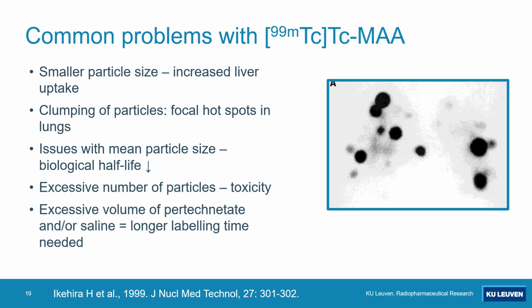Also, if you have too large a volume of your pertechnetate, even though you will only use a little bit of this for your patient, and it's all really safe, it will increase your labeling time needed to make a fully labeled technetium MAA.